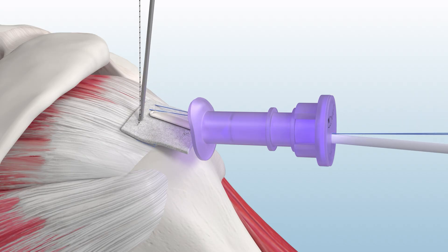Now, secure Biobrace to the rotator cuff by tying one set of medial suture.